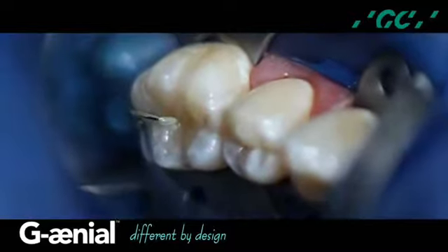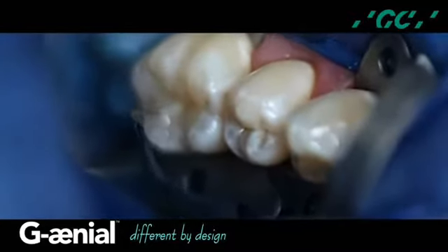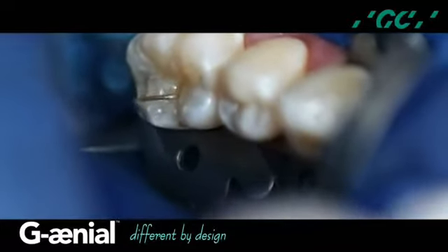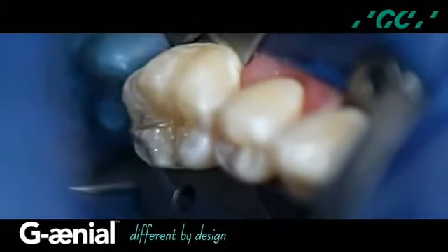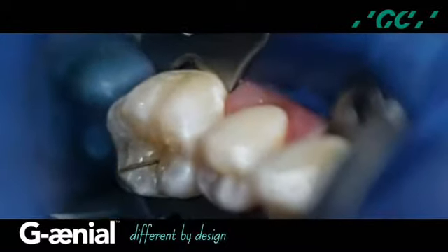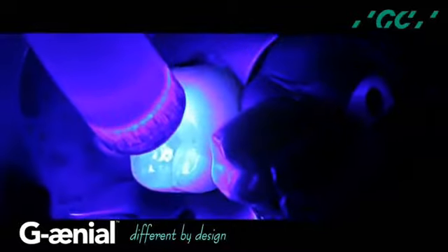Notice the stability of the material on the explorer tip. This characteristic allows precise placement. I continue to develop the ridges and planes with an A2 shaded flowable as my final dentin layer, developing the anatomical morphological characteristics, the planes, the ridges and grooves, and light cure for 10 seconds.